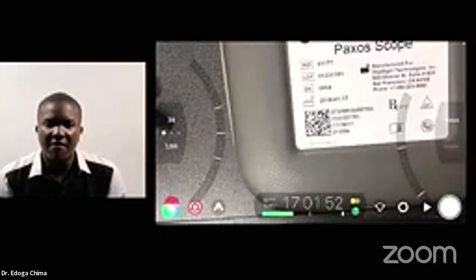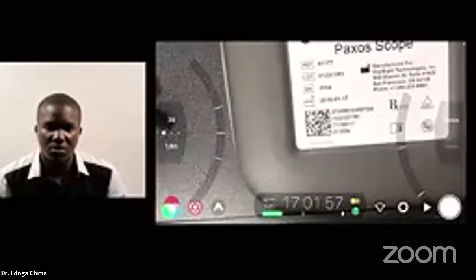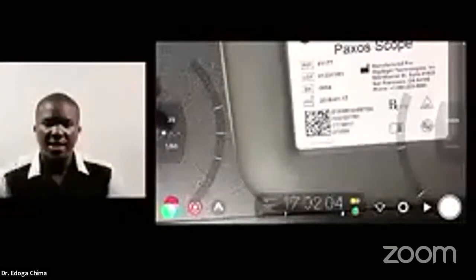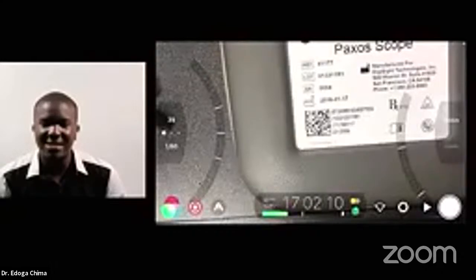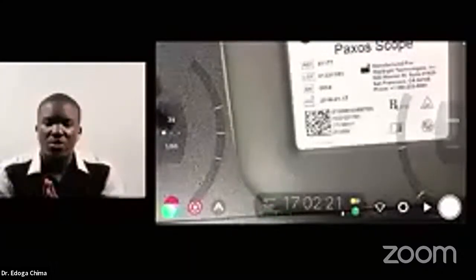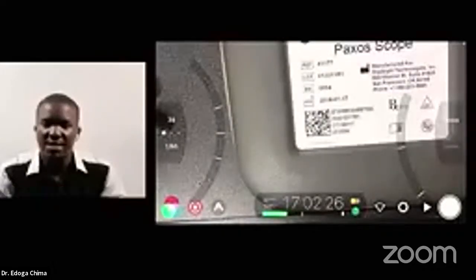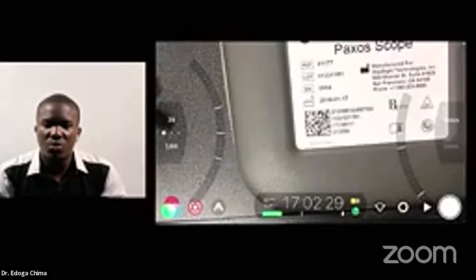So the adapter fixes the lens phone distance. That's what the adapter does. It fixes the lens phone distance, because this is a distance that you would otherwise have to modify as you modify the lens eye distance. So in order to modify just one distance, which is the shorter distance, the working distance between the eye and the lens, which is around 5 cm plus or minus 2 cm, you fix the distance between the lens and the phone.